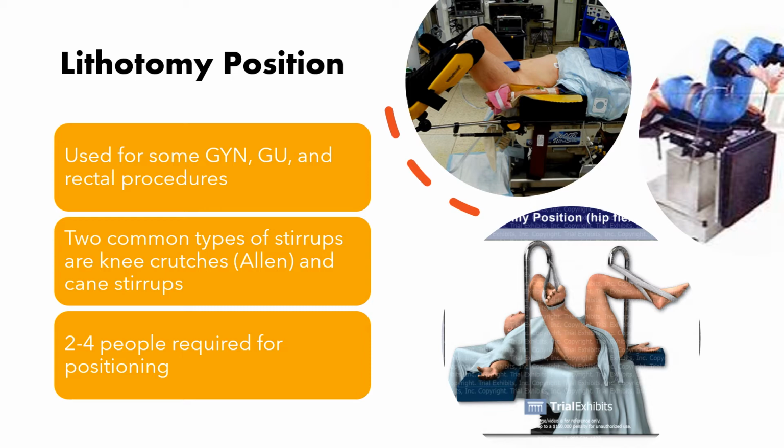So these can be manipulated, turned, raised, lowered, whatever. If there's nothing that we can do to keep that leg from resting against the candy cane, then we need to put some sort of padding between the stirrup and the patient's leg.